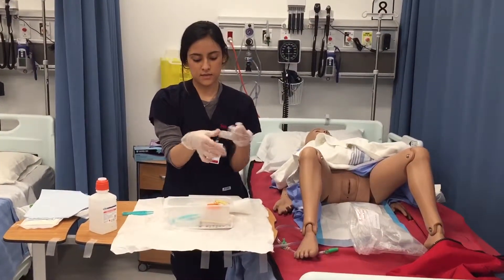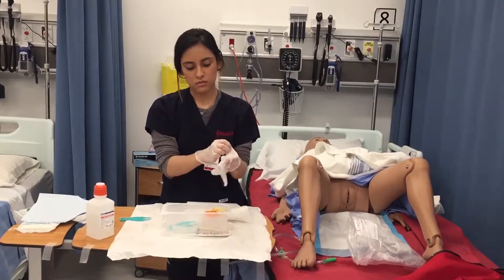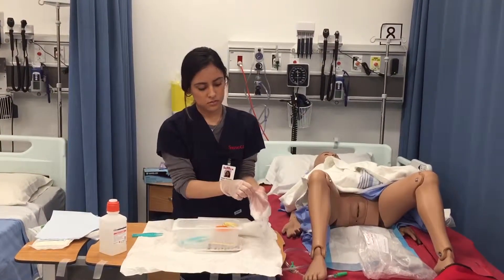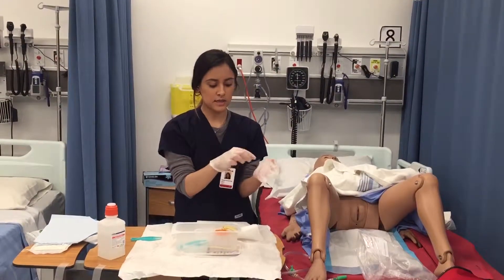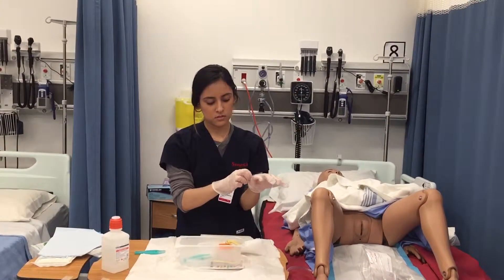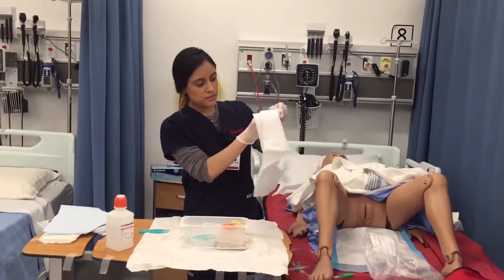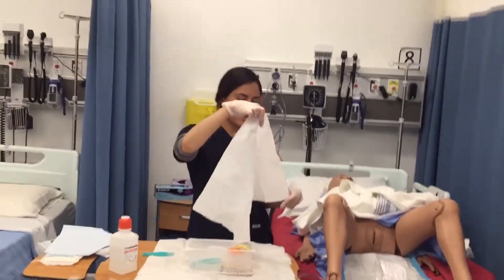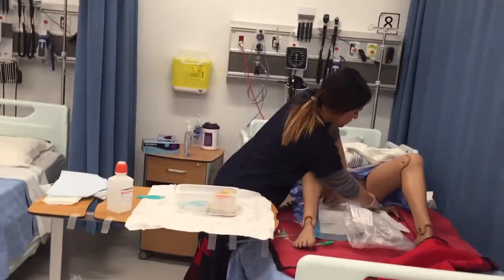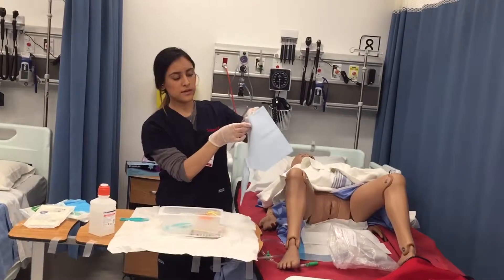Now that my gloves are on, I can fix things up. I made sure I didn't touch the inside of the drape, so I'm going to provide the sterile field — making sure the shiny side is facing up. And lastly, I'm going to place this final privacy drape.